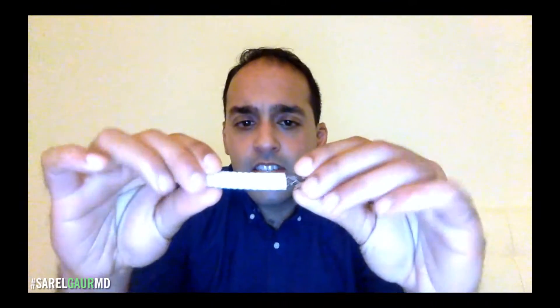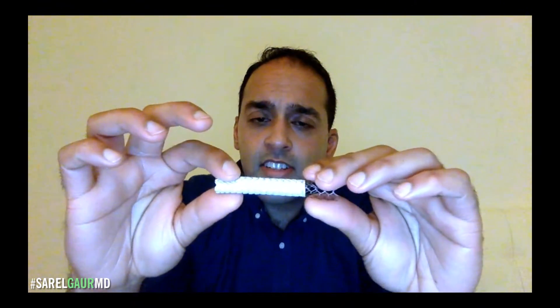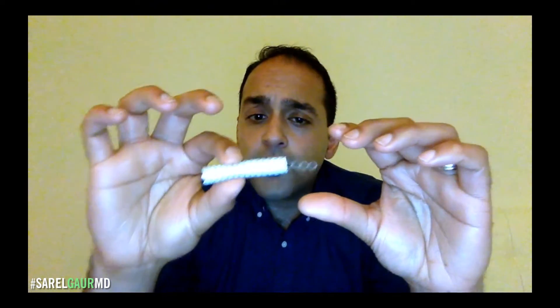You are now listening to SorelGoreMD — don't forget the MD. I've been wanting to make this video for a while, and I sort of forgot about it, and I just got a serious reminder about how I need to talk about this. This is a TIPS Viator StentGraft, made by W.L. Gore and Associates, and I'm really excited to have this and to be able to talk about it with you guys.